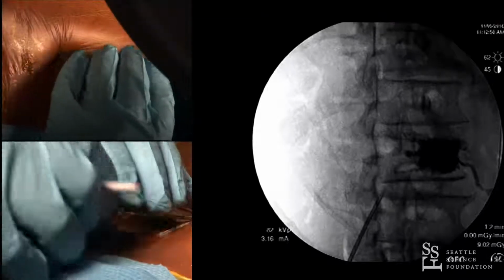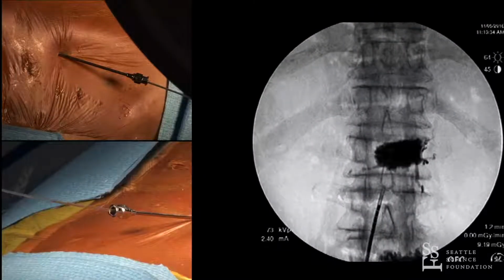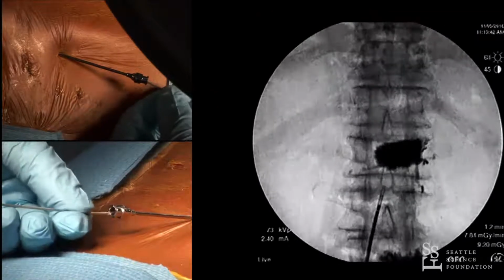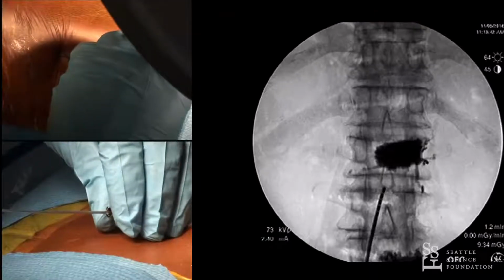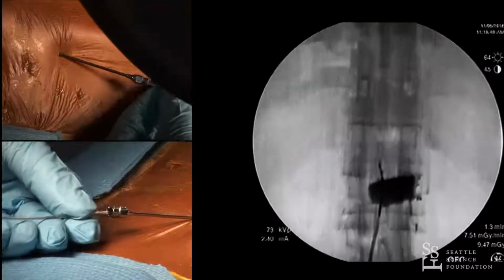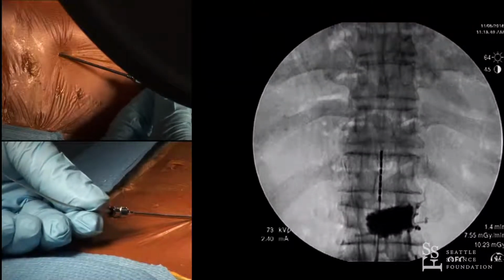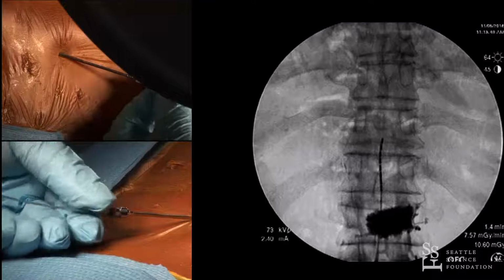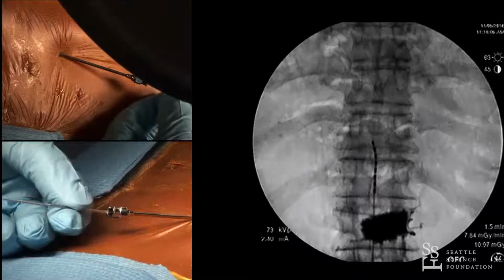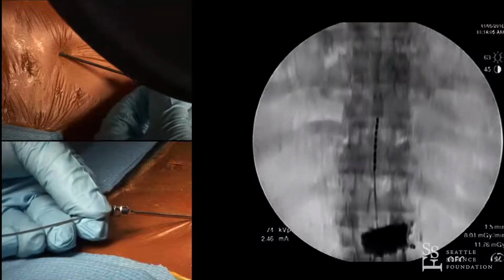And Dr. Poree, what would you say for our audience the angle at which you're entering with the needle to the skin? Less than 30 degrees at this point. Excellent. And I'm going to sort of position this more to a 12 o'clock position as we come out. And then try to stay along midline. You can see there a little bit of blockade there, maybe an osteophyte on the surface, but stay along midline and then make your decision about what your target is.